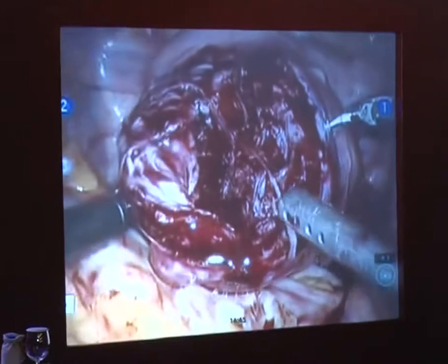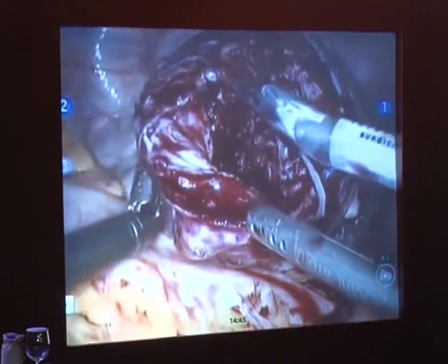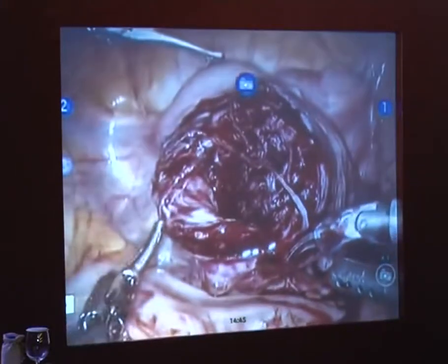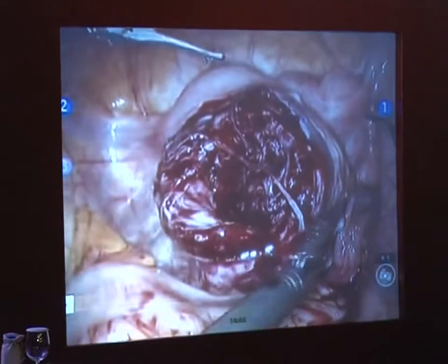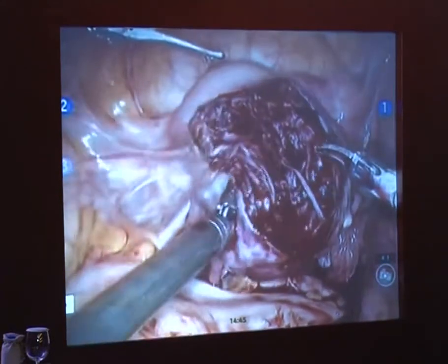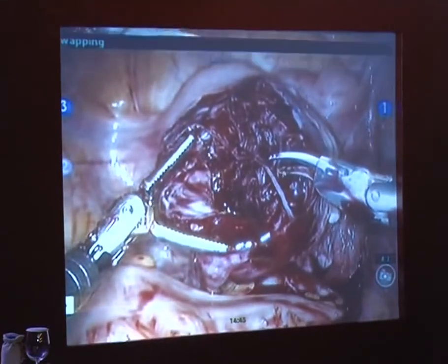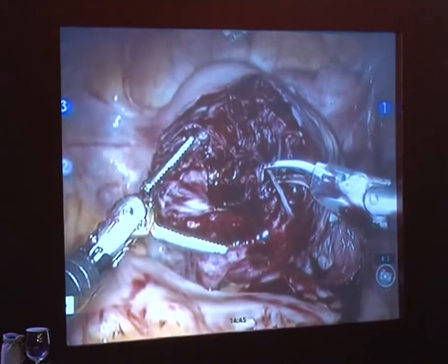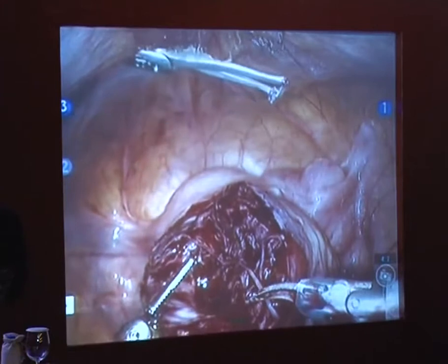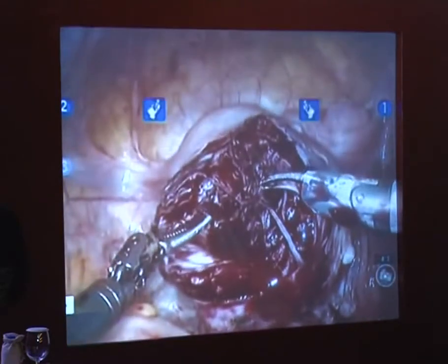Can you guys put the mega needle driver in, please? Thank you. Mega driver. Doing slider, that's great. Okay. So I'm going to use a running barb here in this case. At this point, we don't really need a tenaculum too much, just going to sit there out of the way. Can you suction just in here briefly for me?